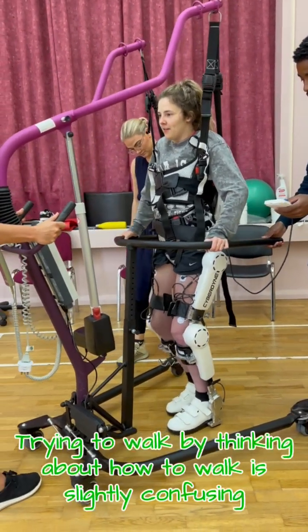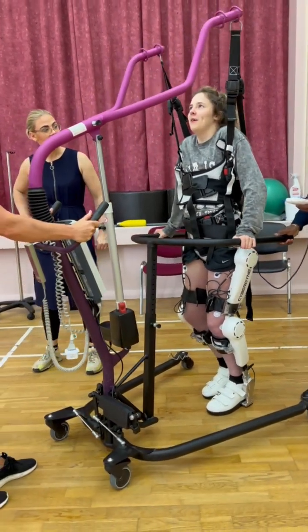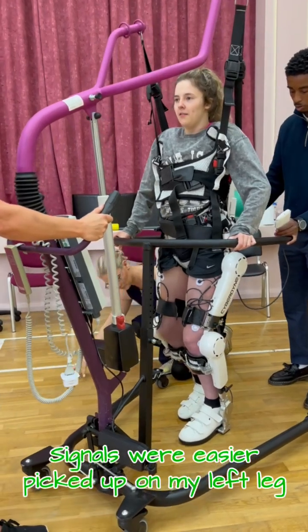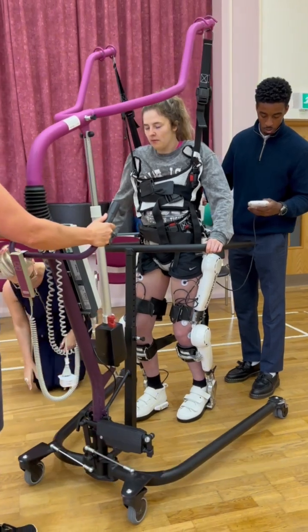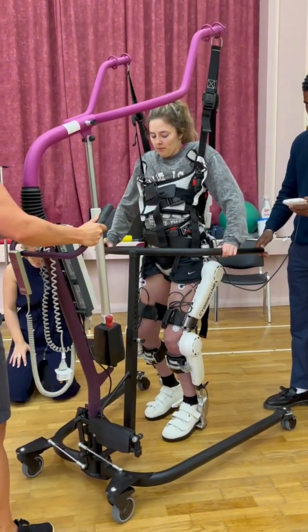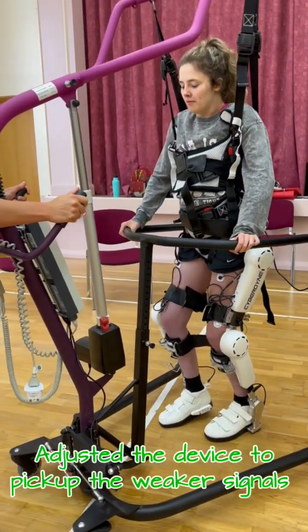Trying to walk by thinking about how to walk is slightly confusing. Signals were more easily picked up on my left leg. My right leg needed some extra assistance to start, and the device had to be adjusted to pick up the weaker signals.